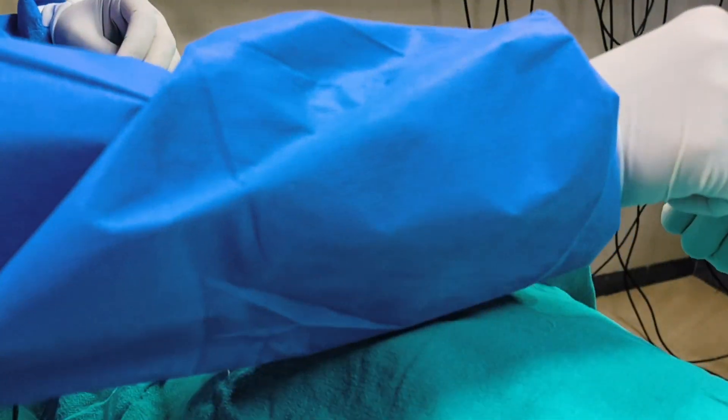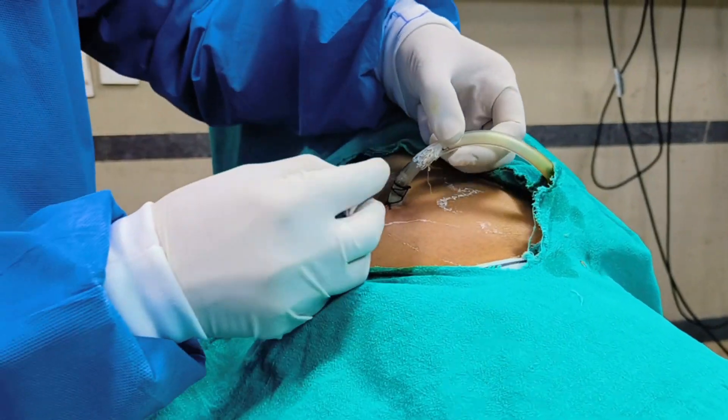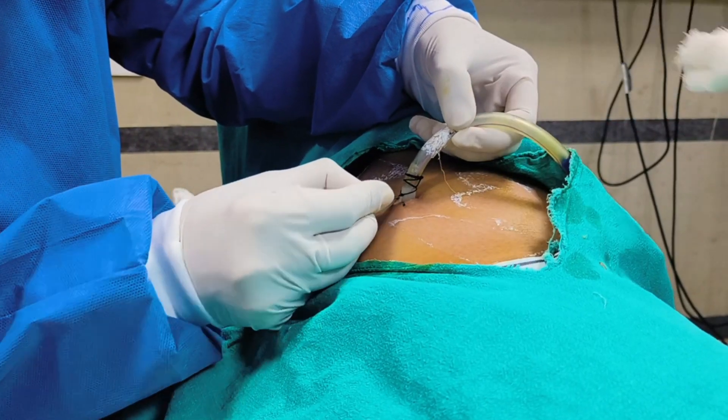Now we will remove the suture gently. We have given one suture, so we will remove it.